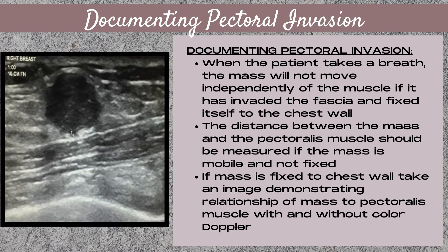The muscle will move and the mass will not be fixed to the chest wall. If we can see the mass move independently of that muscle and it's not fixed, then we want to measure with our calipers the distance between the mass and the pectoralis muscle. This is to demonstrate to the radiologist that the mass is not fixed to the chest wall, that we can see movement between them.